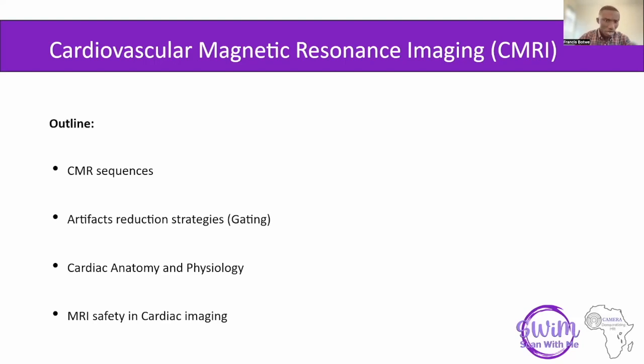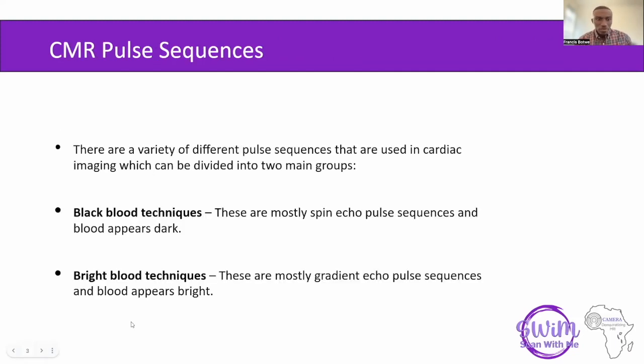So I'm going to walk you through the CMR sequences and how to reduce artifacts in cardiac imaging, cardiac anatomy and physiology, then MRI safety in cardiac imaging.